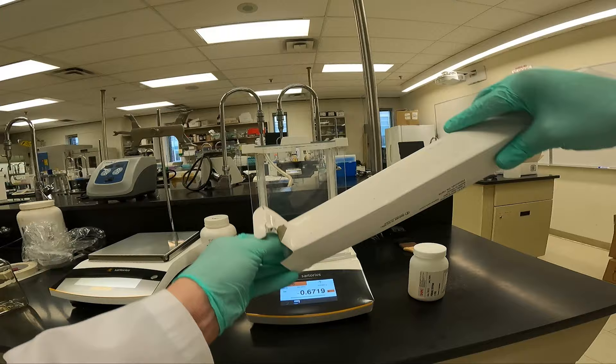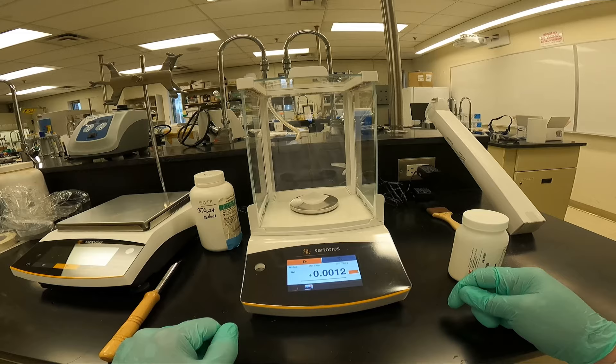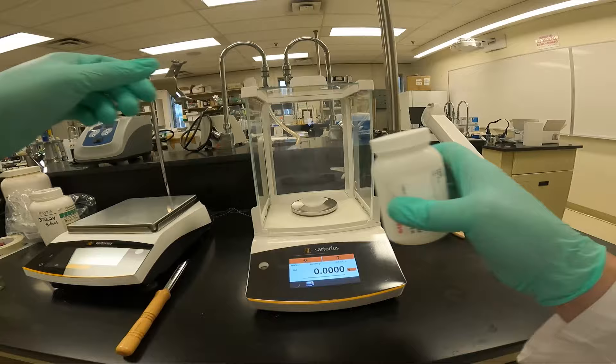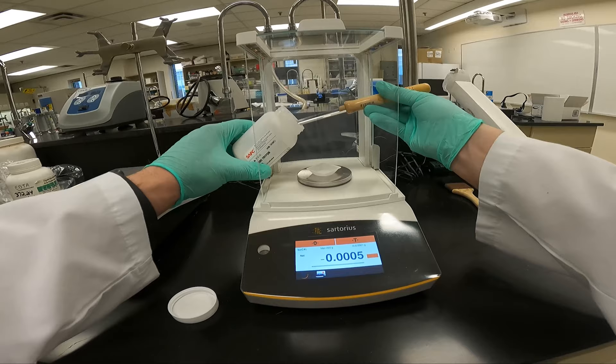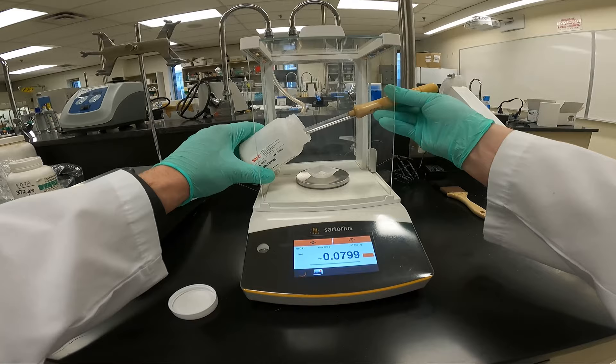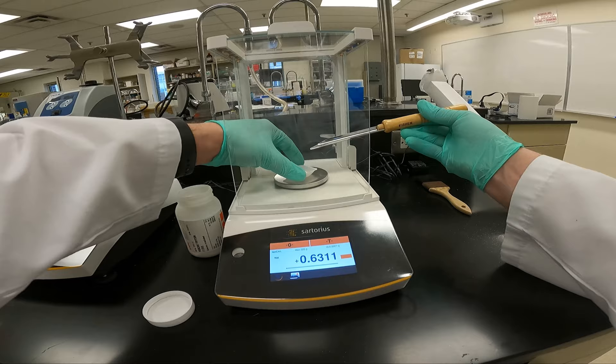We've done the calculations. I'm going to measure out 0.375 grams for a 150ml solution. We place on our weigh boat and we tear it.